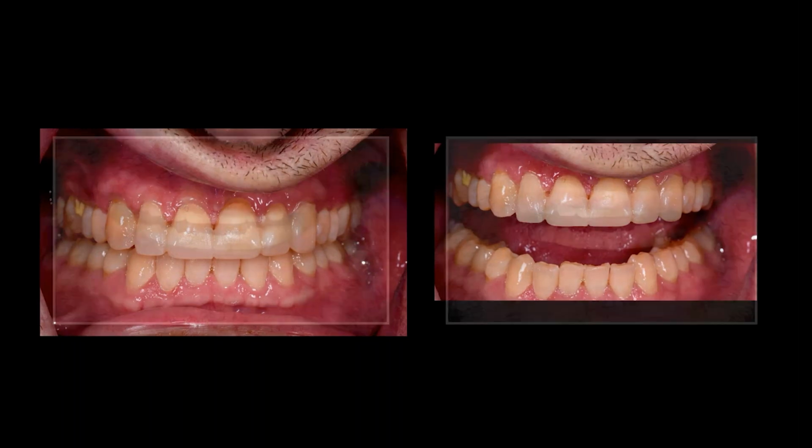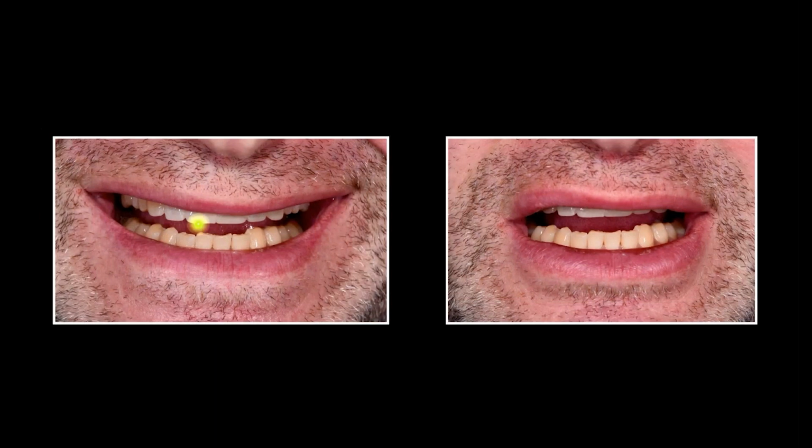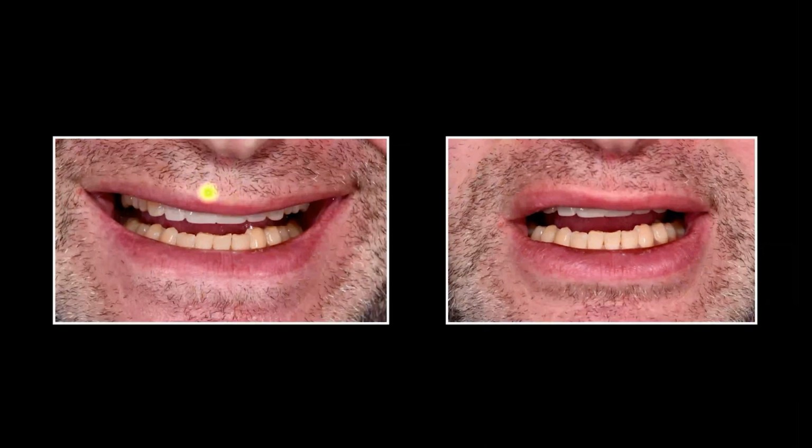But it becomes obvious in his face that even with a 10.5 millimeter, almost 11 millimeter central, he's not going to show very much tooth structure unless he has a lip augmentation done. They can cut the lip and pull the lip up a little bit. So if his true want is to show more tooth, we can't make the teeth long enough. Can we go to 11 or 12? Of course we can. Do we want to from a functional point of view? Not necessarily, unless we have full mouth control of all the restorative options and we can work with the envelope that we're going to do.